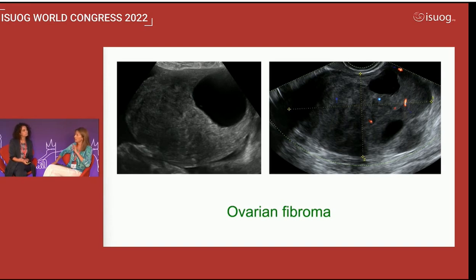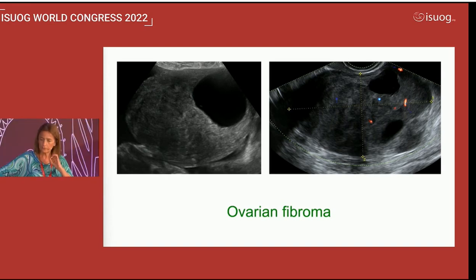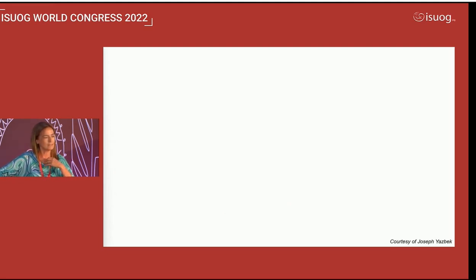So we are giving great value to color in this moment. We have to be careful. I know, because in ADNEX the engineers were able to exclude the color to provide the model. Yeah. But here we are talking about rare tumors. Let's go on because time is running.